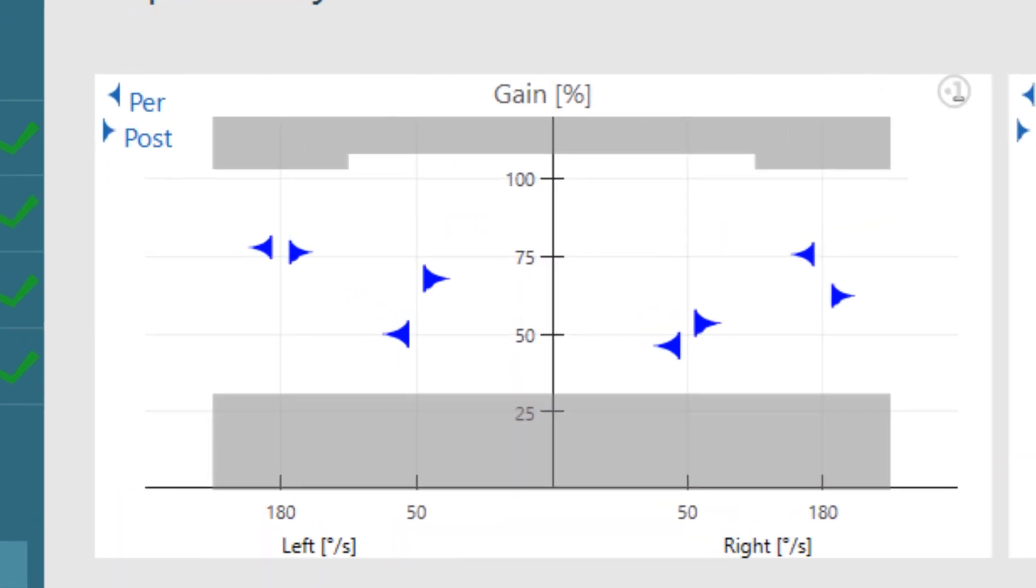The gain assesses whether the amount of nystagmus produced was proportionate to the amount of acceleration. This gives a gross understanding of the vestibular function. You can see that the normative data is quite broad. There is a low sensitivity for any deficits in gain percentage measurements.